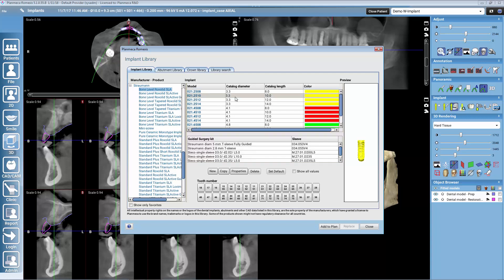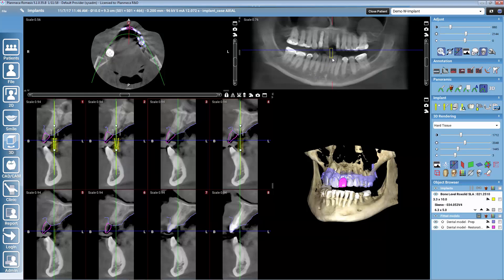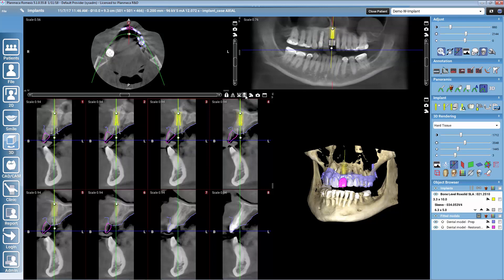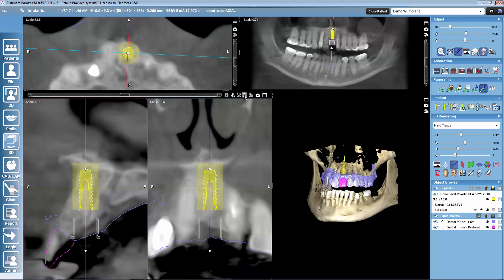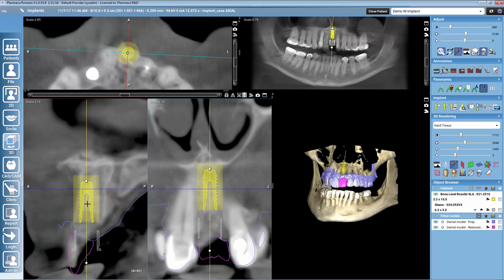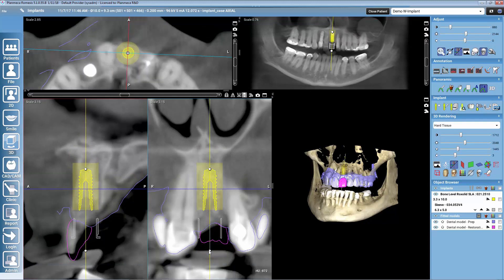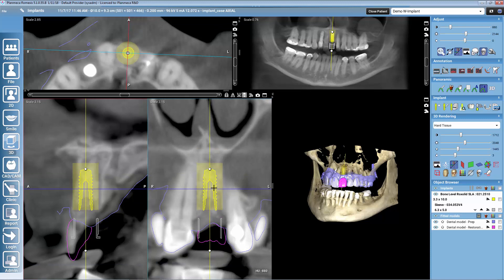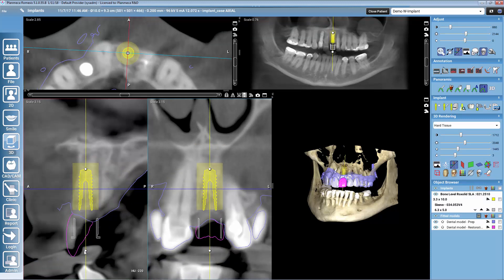Once we select any implant from the library, Romexis gives us a list of the possible surgical kits. I will use Straumann's own sleeve. We add to plan, and then I will use the implant-centric view to place the implant well. These two slices are always centralized in the implant, and I also see the cuts from the restoration design, so I have a good overview of how I want my implant to be positioned.